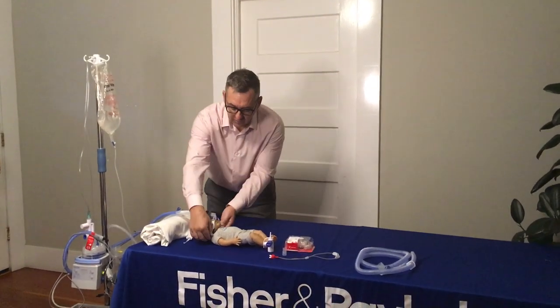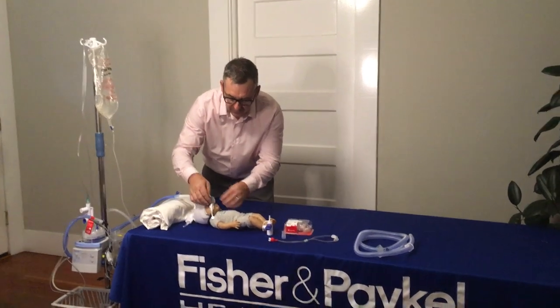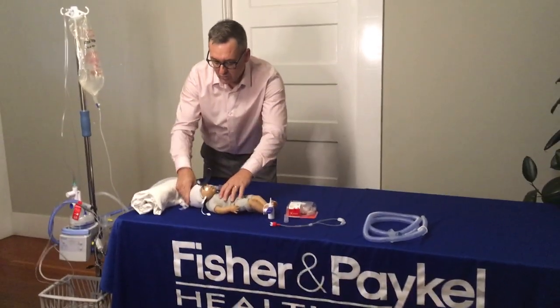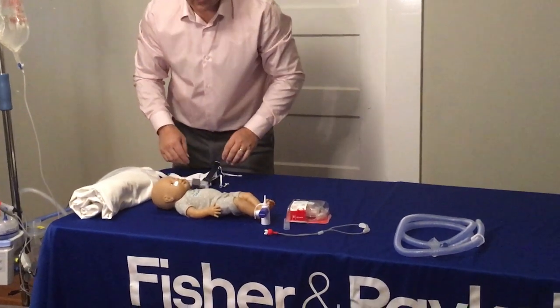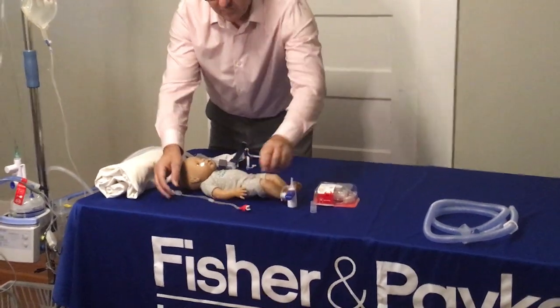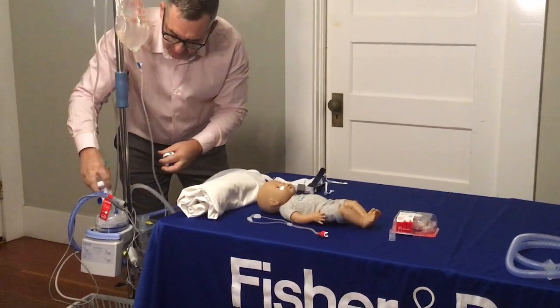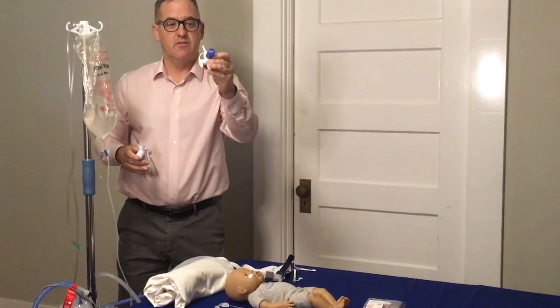We're going to go ahead and move the baby off of the bubble CPAP interface. I've already positioned the wiggle pads onto the baby's face, removed the bonnet and headgear, and set those to the side. We've already sized the cannula — this baby is going to be a red. This is very important: you need to change the pop-off from the bubble CPAP pop-off, which is set at 17 centimeters of water pressure, to 40.